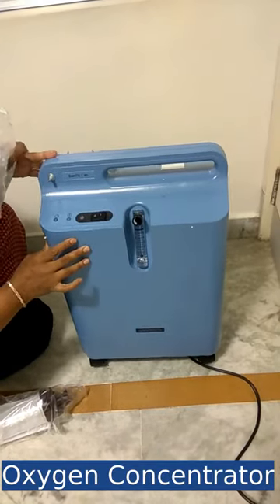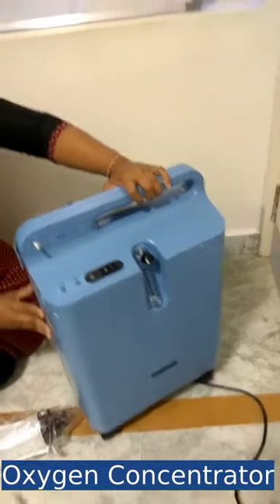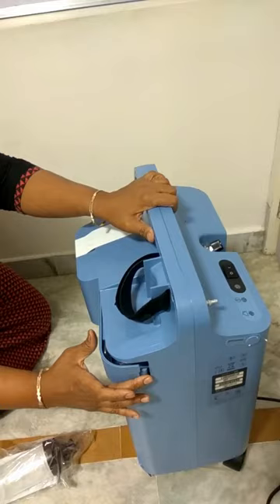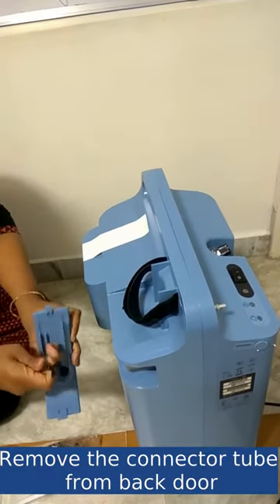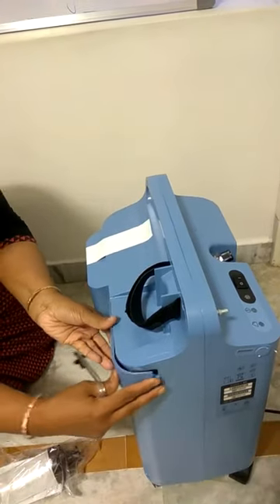This is the oxygen concentrator. It is inside a door like this — you have to open this door. There is a connection tube which needs to be connected to the humidifier bottle. I will show you how to do this.